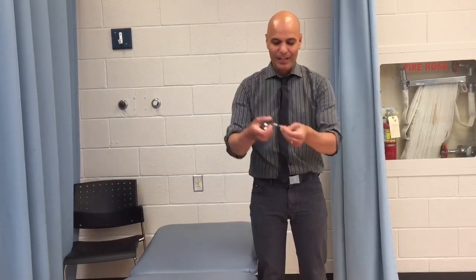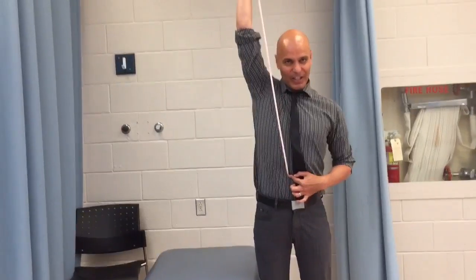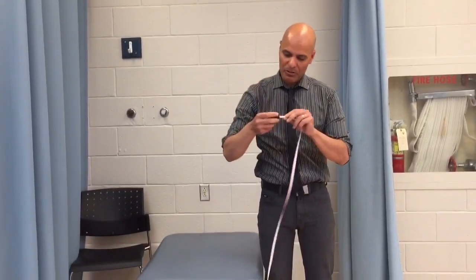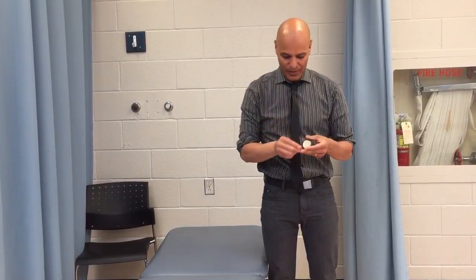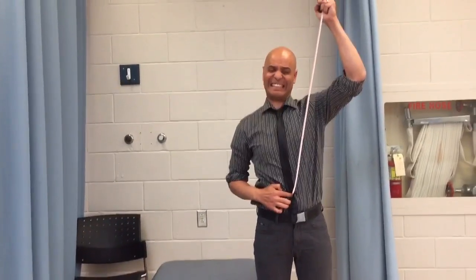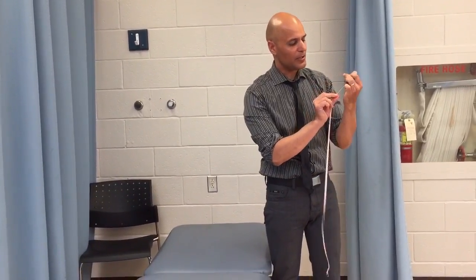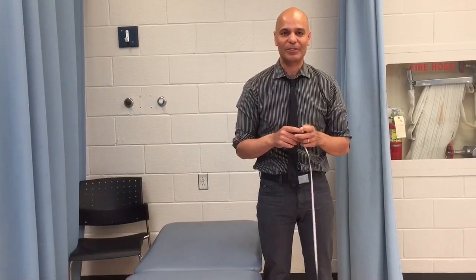The first outcome measure I call the active reach-up test. You ask the patient to hold a regular measuring tape on their belly button — I let them find their own belly button — hold it in their hand and lift up as high as they can go. When they bring it down, I measure: 101 centimeters. We compare it to the other side, and that measures 82 centimeters. I find it's accurate to the nearest two centimeters.